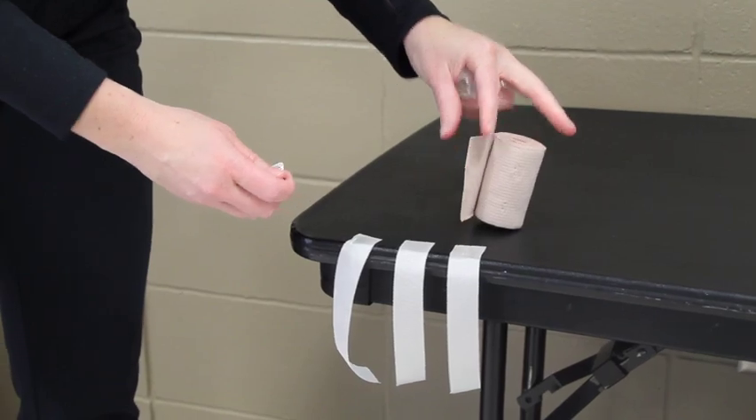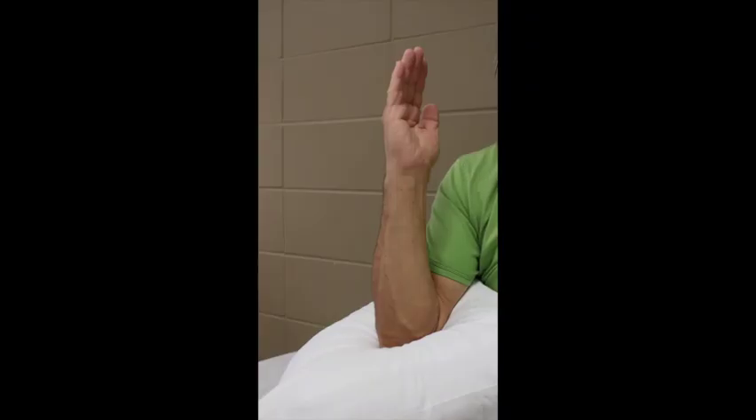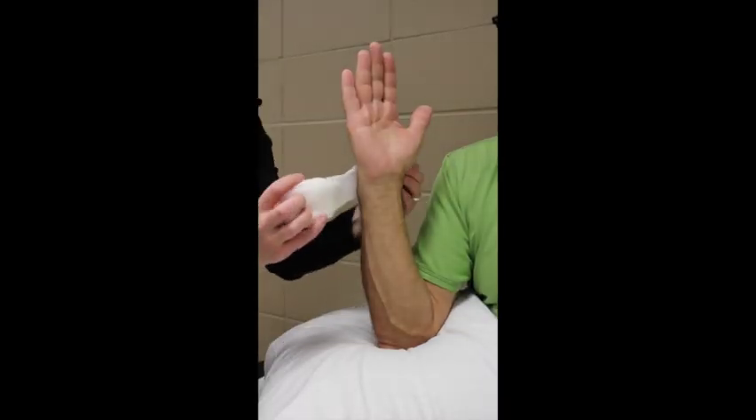To begin, position the patient in a comfortable seated position — this could be at a desk with the arm resting on the tabletop, or on top of a gurney or exam table with pillows under the arm for support. Advise the patient to point fingers toward the ceiling and thumb towards the shoulder.